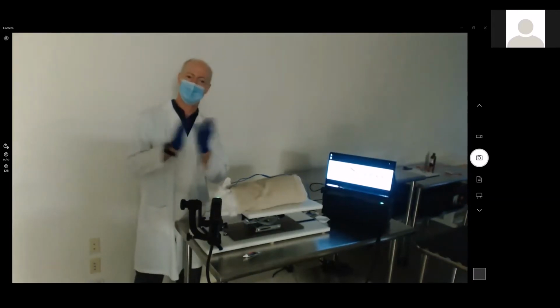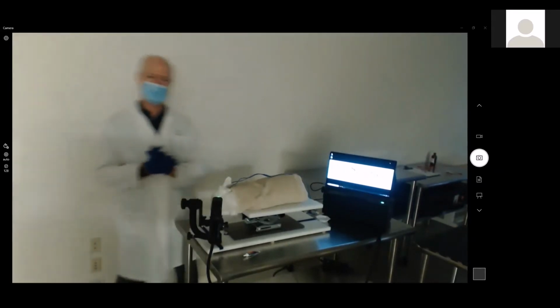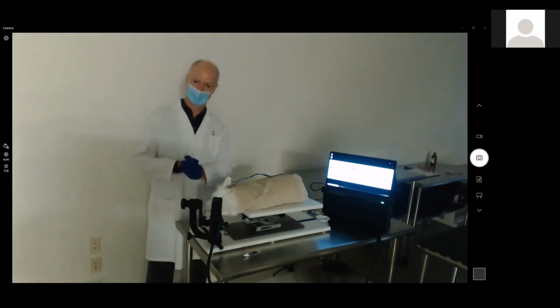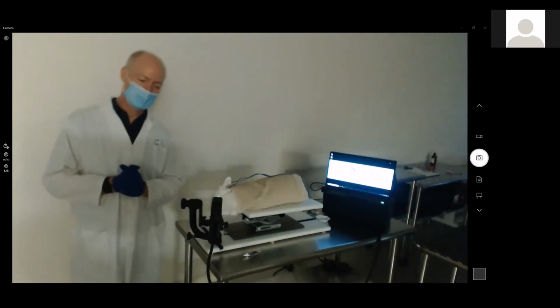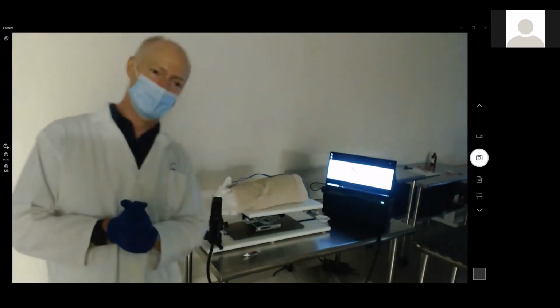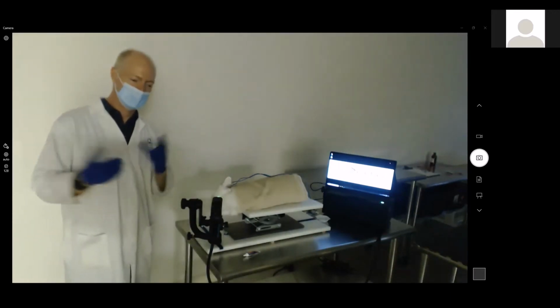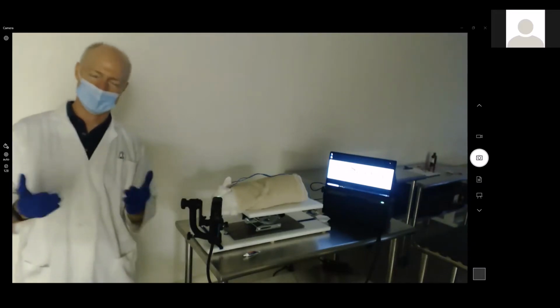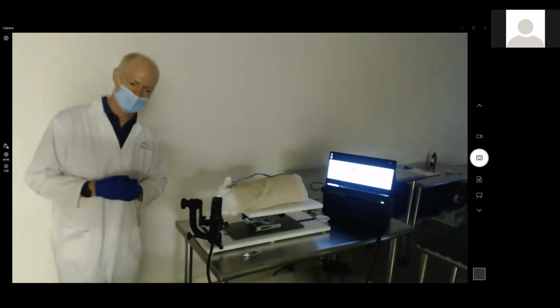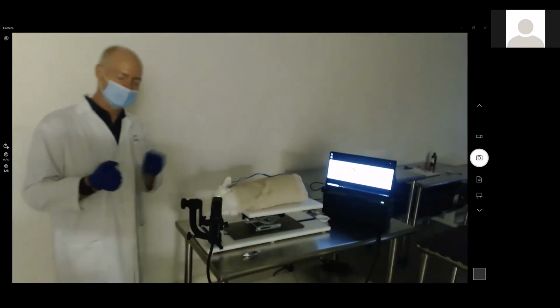Most people are very familiar with trying to get imaging using ultrasound. And it is very similar to trying to capture an ultrasound, except you're now working at a 5-micron axial resolution. Most typical, even a UBM, one of the best UBMs, the best they can do is approximately about 30 microns in resolution. So any type of motion, any type of movement is just an amazing change.